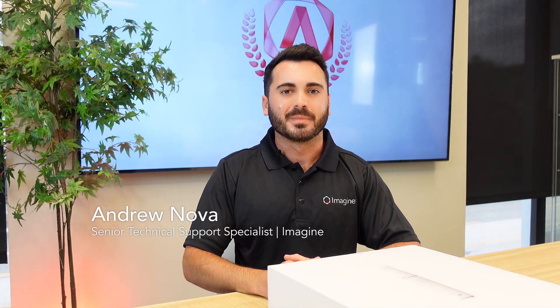Hey everyone, my name is Andrew Nova with the Imagine USA Academy team, and today I'm going to be unboxing and demonstrating Metis' latest intraoral scanner, the i900.